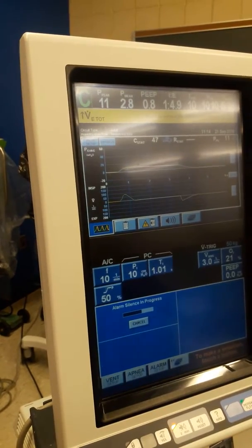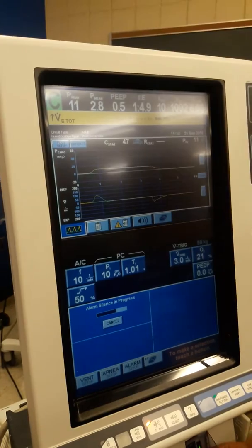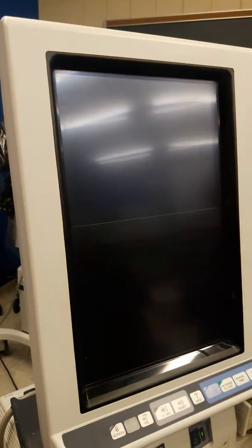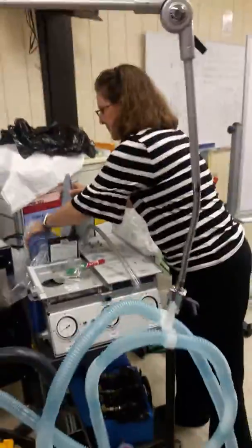What you would feel is that difference when you go to ventilate.